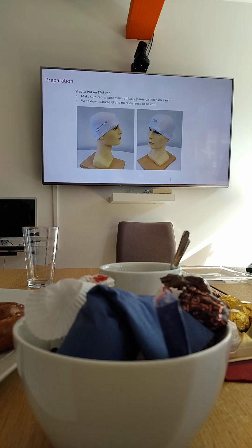So, put on the TMS cap. Important is that you place it symmetrically, so the front side is here, and you get all the information, all the power points.